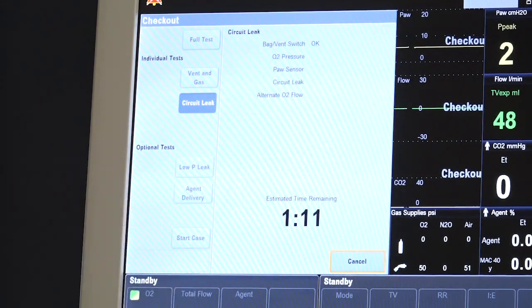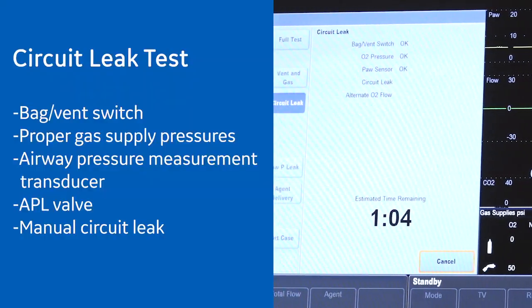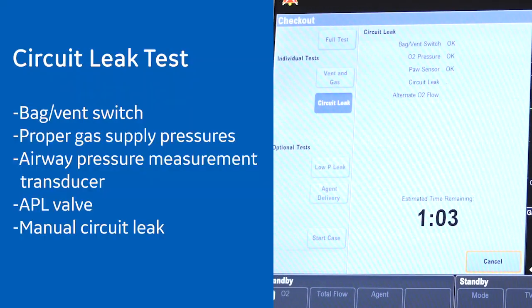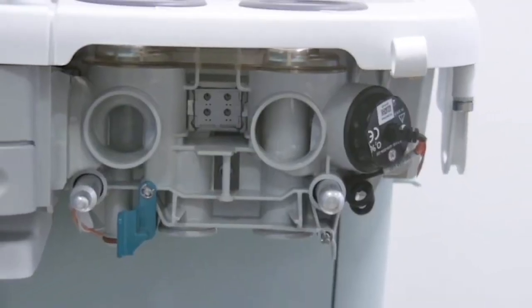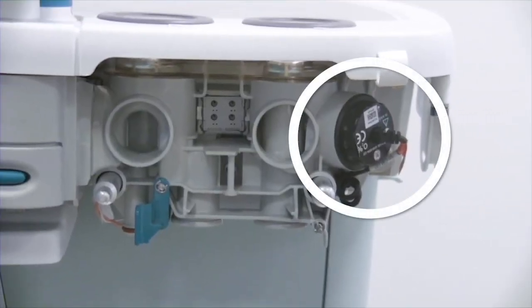The circuit leak test checks the bag to vent switch, proper gas supply pressures, airway pressure measurement transducer, APL valve and manual circuit leak. Perform a check on the O2 cell if there is no integrated gas module.